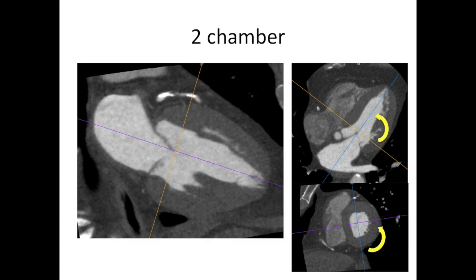The second view is the two-chamber view. This involves turning your axes so that one is going all the way down to the apex of the heart and just adjusting slightly on your short-axis view, giving you a two-chamber view. The two chambers we're talking about here are the left ventricle and the left atrium. This is an important view because it gives you a good look at the mitral valve in action and the left ventricular muscle contracting.